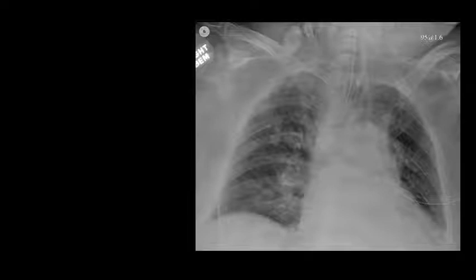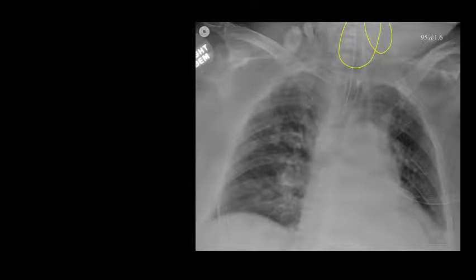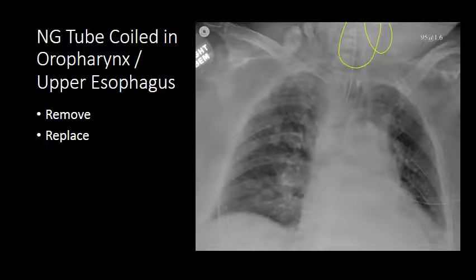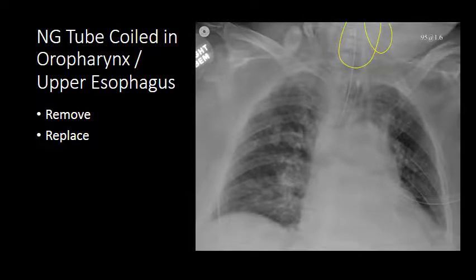Here is another example where a chest x-ray was obtained after nasogastric tube placement. We do not see a nasogastric tube passing down the mediastinum. Instead we see loops of the nasogastric tube up over the neck, and again this is a nasogastric tube coiled within the oropharynx and upper esophagus. It needs to be removed and then replaced.